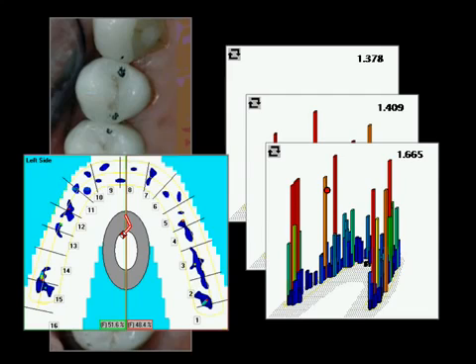And finally then, more contact occurred. You can see that the bicuspid picked up, more of the 15 picked up, more of the 14. But the 11, that small mark, was a primary contact. So through this instrument, we can depict which contacts have more force and which contacts, out of all these contacts, appear first. That's the true prematurity. When we apply it to the implants, we can delay the contact on the implant until the natural teeth have first contacted.